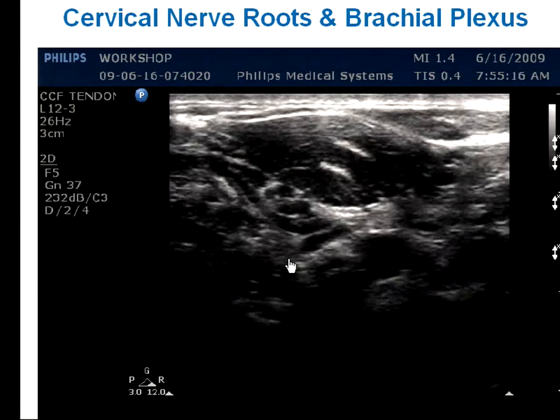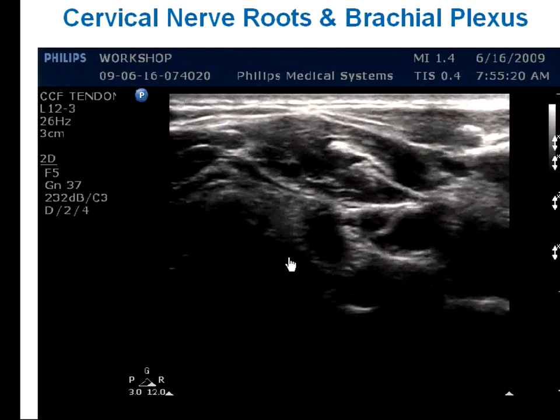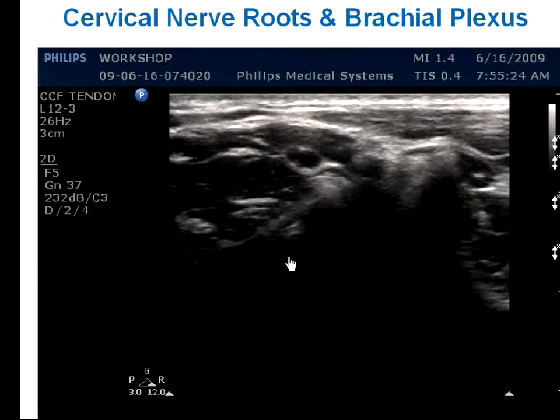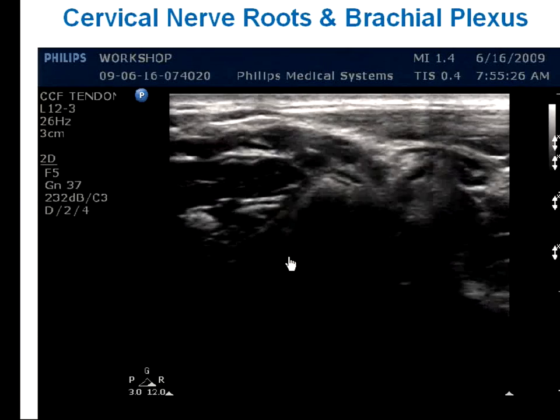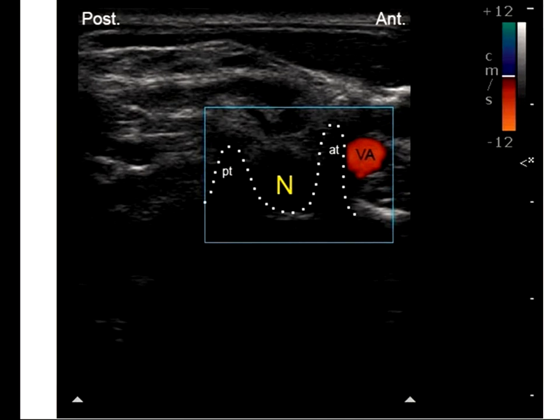We'll let it run one more time. Vertebral artery, C7 nerve root, posterior tubercle. We'll go higher. The vertebral artery will go inside the transverse process of C6. So now we have identified C6 and C7. This is what I'm saying: if you follow only the vertebral artery, you might be misled in 10-12% of patients because it can be anterior to the sharp anterior tubercle of C6.